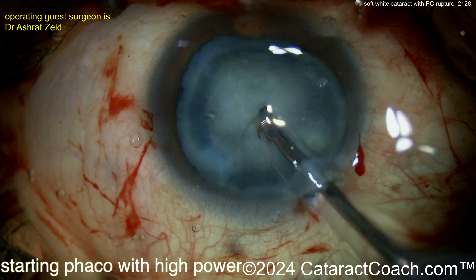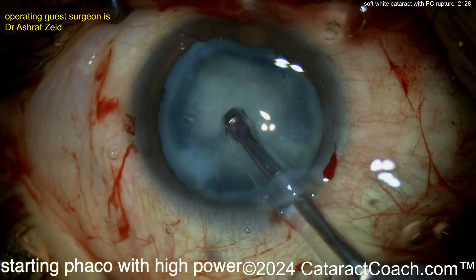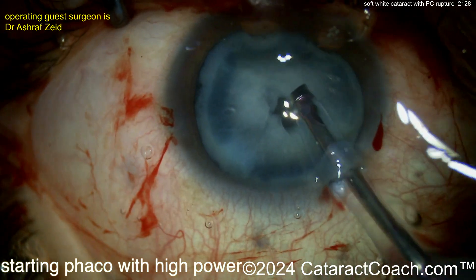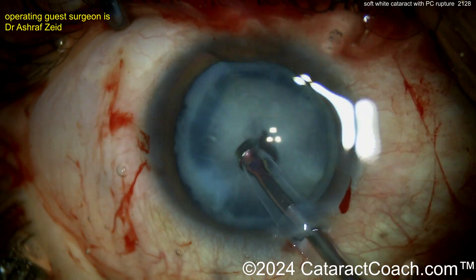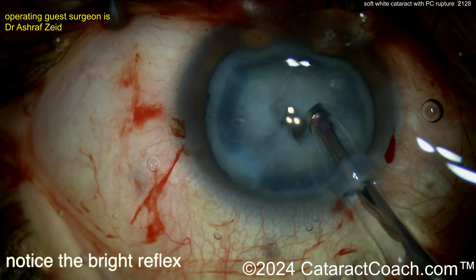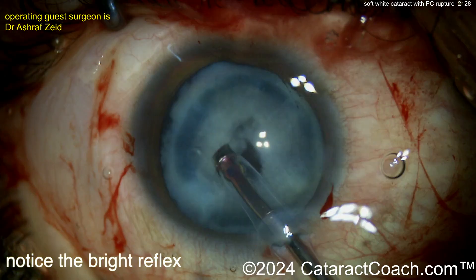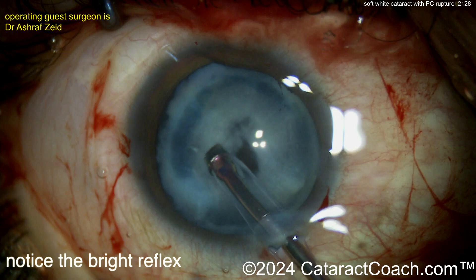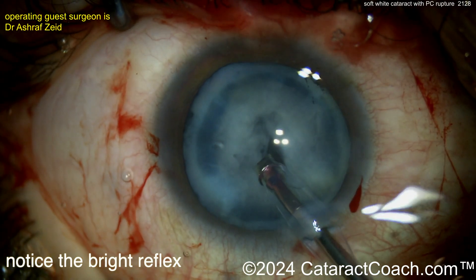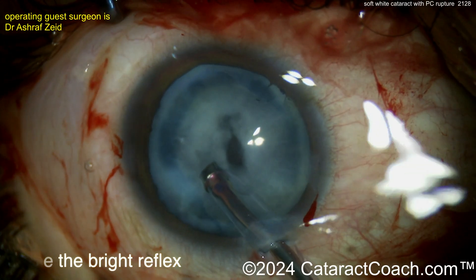Going over the phaco probe — don't go with high power, because the problem is high power will go right through that soft nucleus. That thing is like butter; you could probably just aspirate it out. With that hole in the middle and a bright red reflex visible, with a really soft nucleus like this you don't want to use phaco power — use just vacuum. You can often remove these lenses with just vacuum using the phaco probe, or sometimes even just the IA probe.